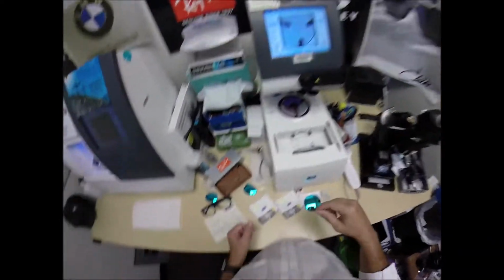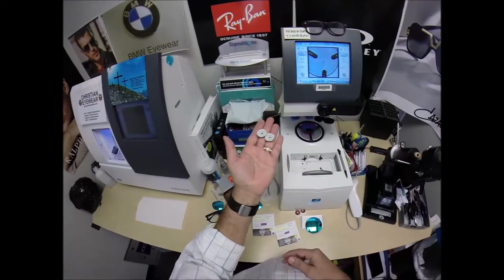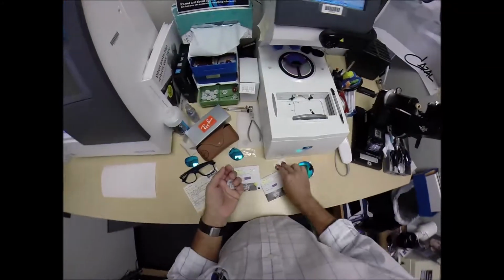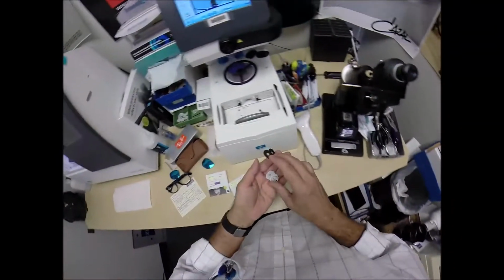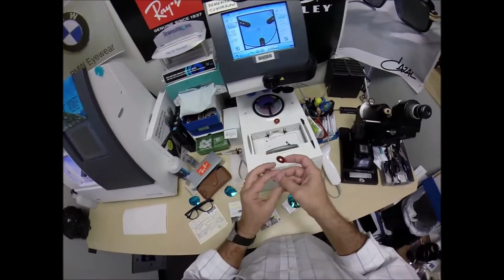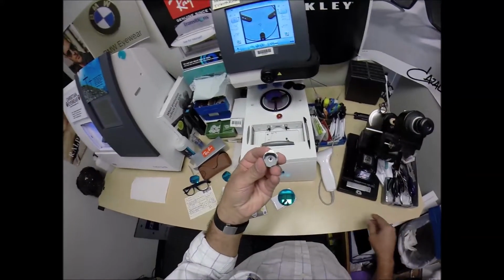Just checking. All right, so this is a block. Points for difficulty here. I need to attach this to your lens while it is cutting. That's not your lens. I saw the color. This is your lens. I need two double-sided adhesive stickers, of which I've got them here. The black side is the sticky side. I'm going to stick this one onto the first block. Do the same thing now for the second one. Pull the paper away to make the black side sticky.